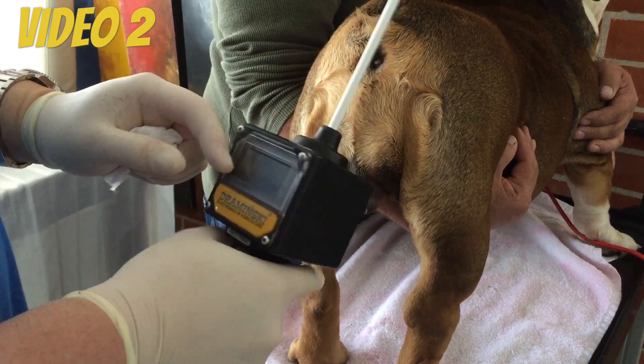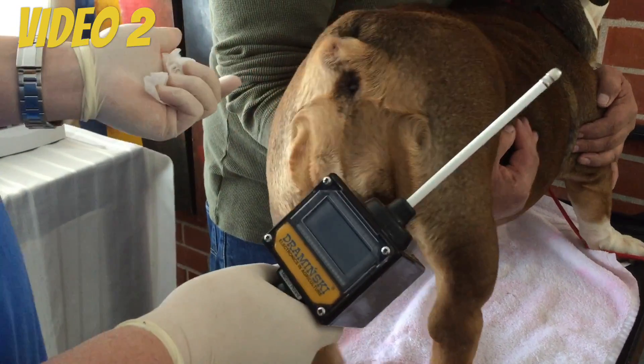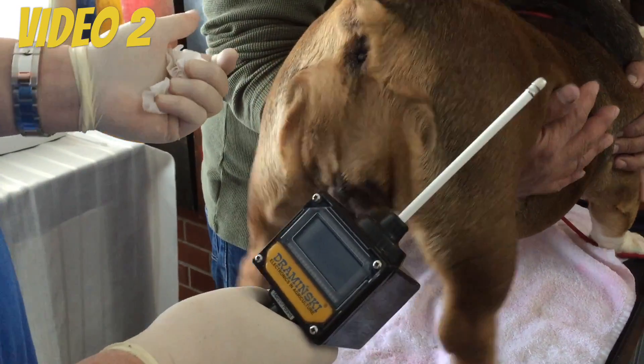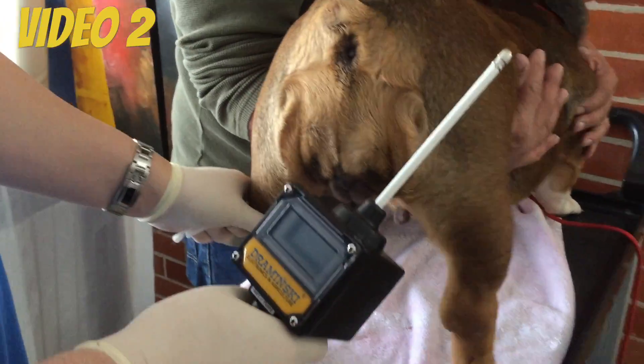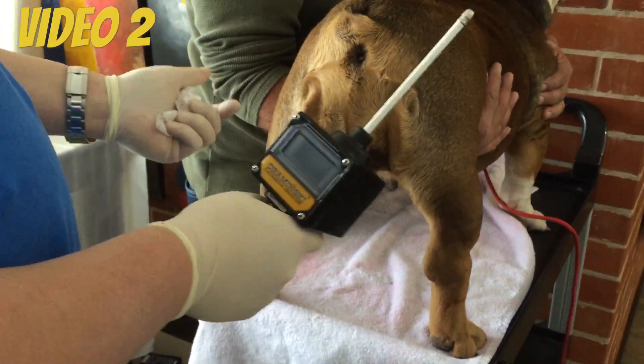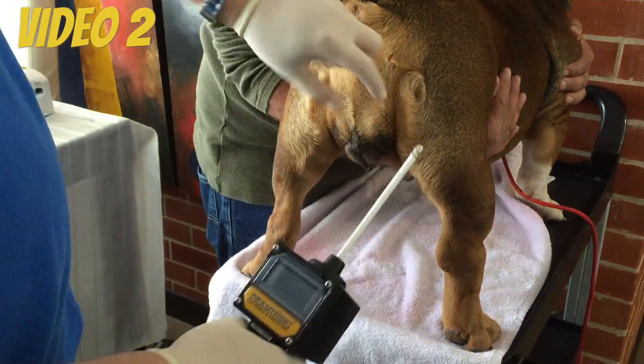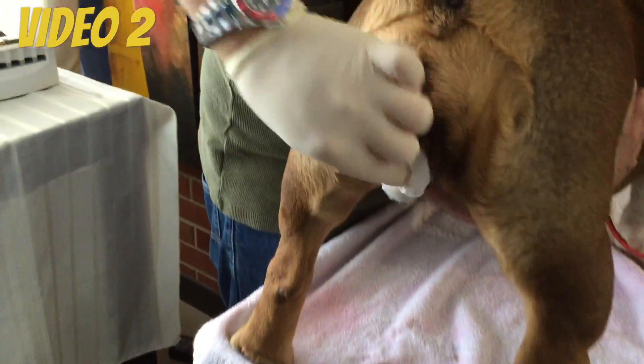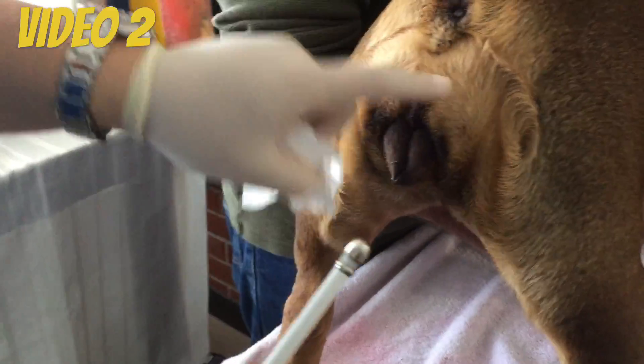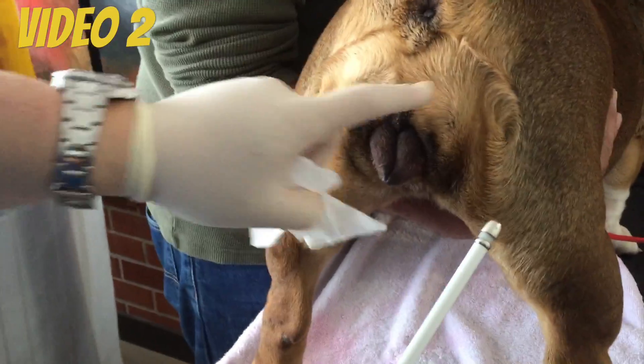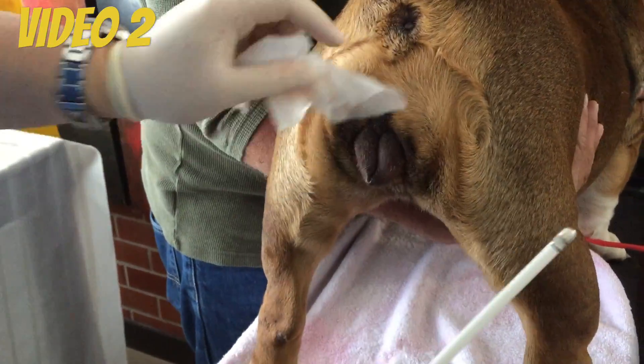Yesterday she was at 970. This means she's been in heat for a couple of days now, like five or six days, but according to the employees, she's only been bleeding for two days. So we turn on the Draminsky. We want to clean her really well. She's already flagging, but according to the progesterone yesterday, she was at 1.48.